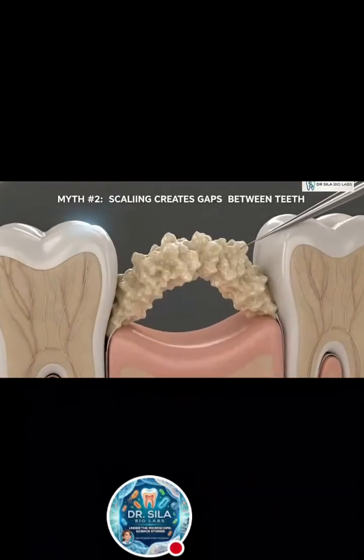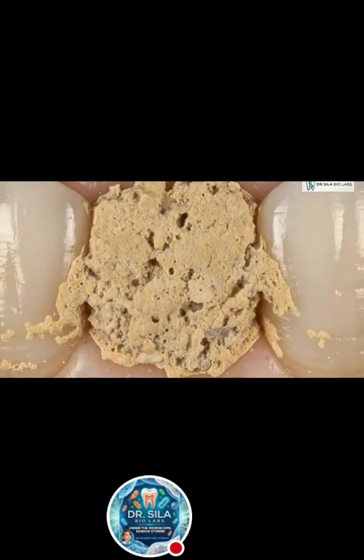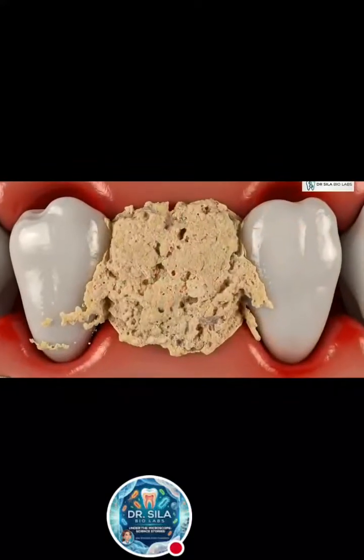Those gaps were already there, filled by hardened calculus. Scaling doesn't create the spaces. It reveals what disease was hiding. The looseness was caused by periodontal disease, destroying the supporting bone. Calculus was simply masking the damage.